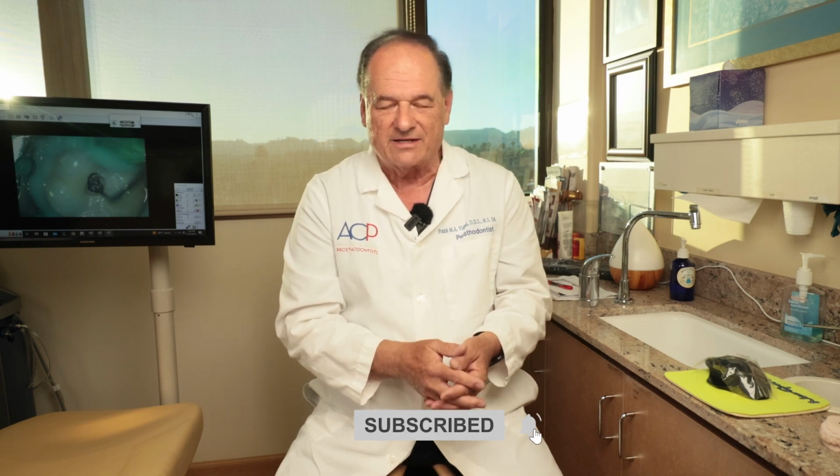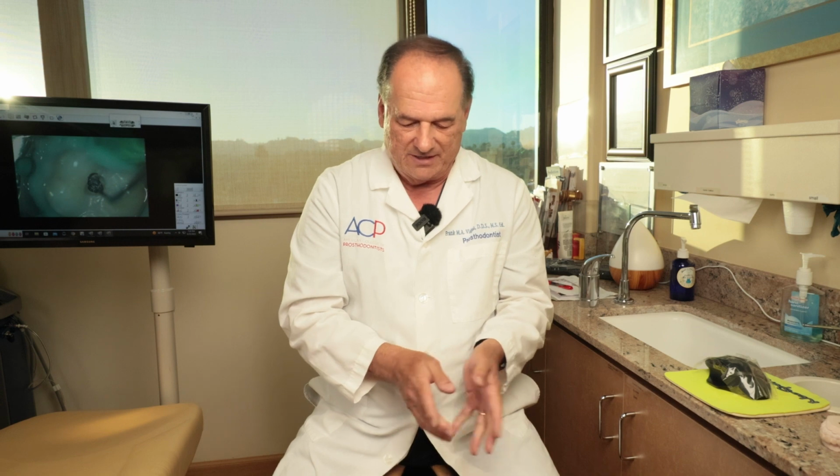It could be cracks in the root. You lost a lot of bone because the crack ended up causing a large infection, so you had a lot of bone loss. The good news today is you have different ways of recreating bone. You can do bone grafting. So in the end, there are few contraindications. Not everybody's going to be a candidate.